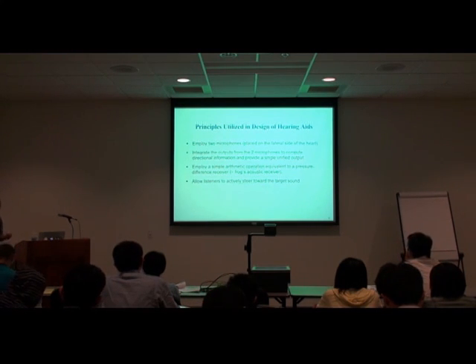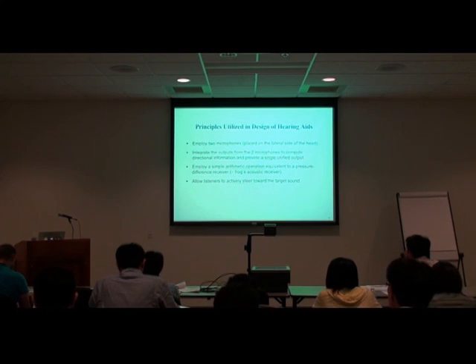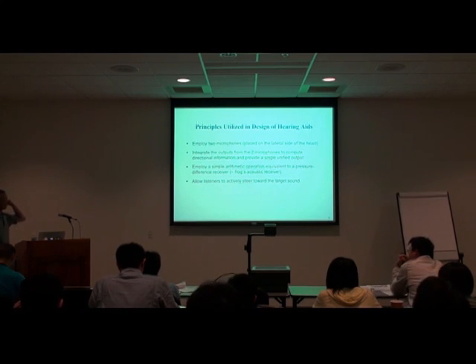So when we design, coming from the outset, we want to design a system that extracts the signal and makes the speech more understandable. So we decided to utilize 2 microphones, either designed around the corner of the eyeglasses or in the microphones in the 2 hearing aids.